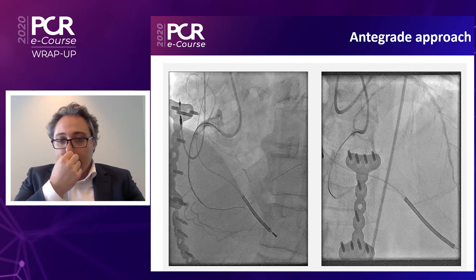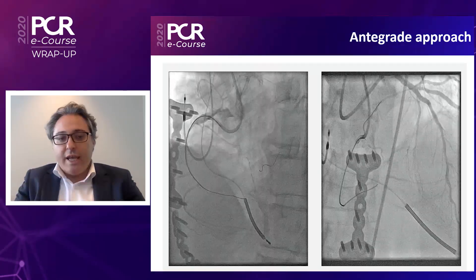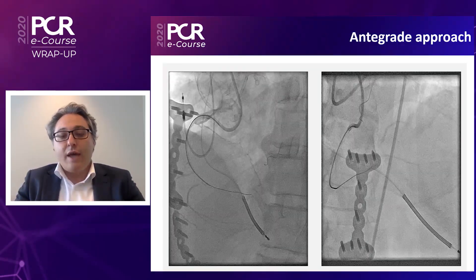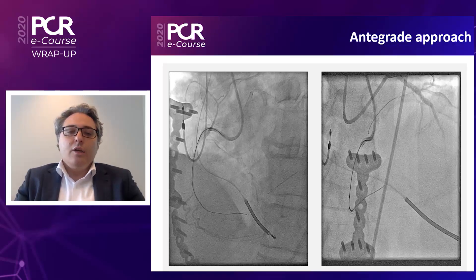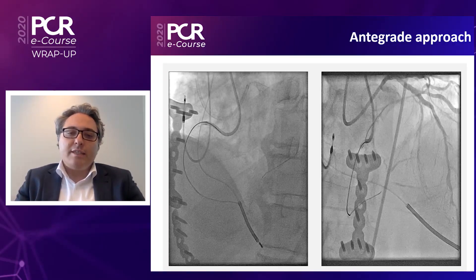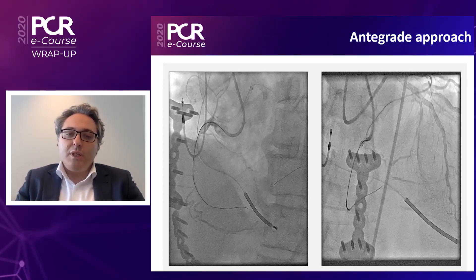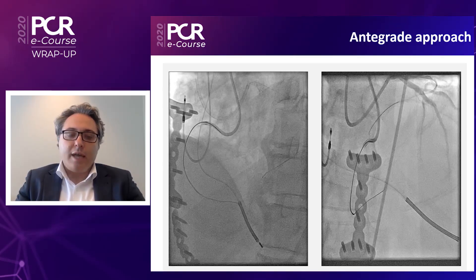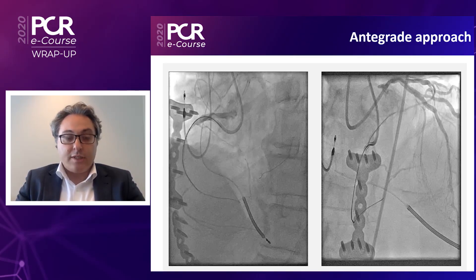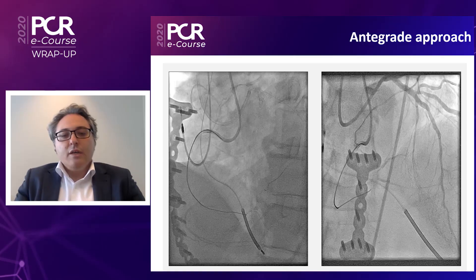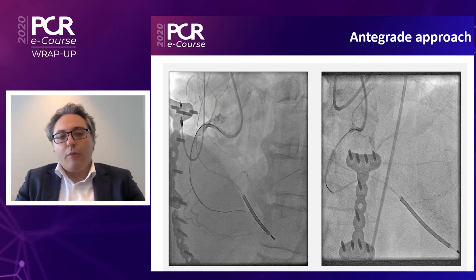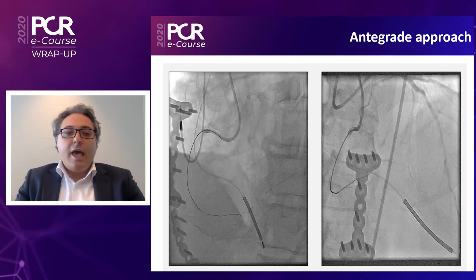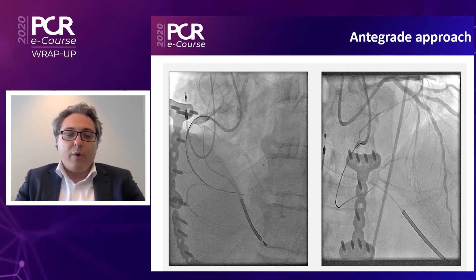We then started an anterograde approach. But as you can see in the right panel, there is already a dissection — the wire went into the sub-intimal space and we were already jeopardizing the bifurcation in the distal right. So we decided to stop this anterograde approach and use another way.